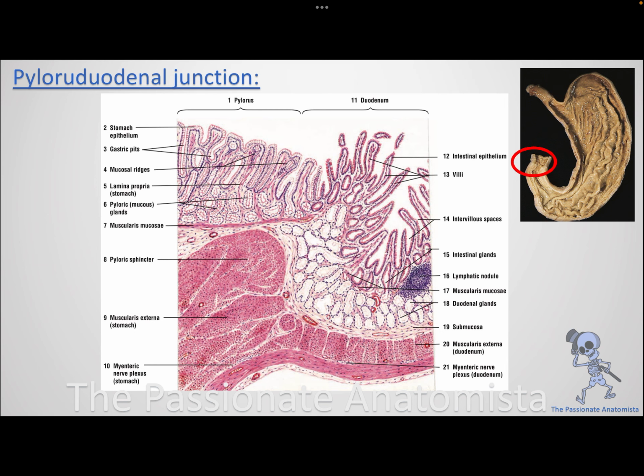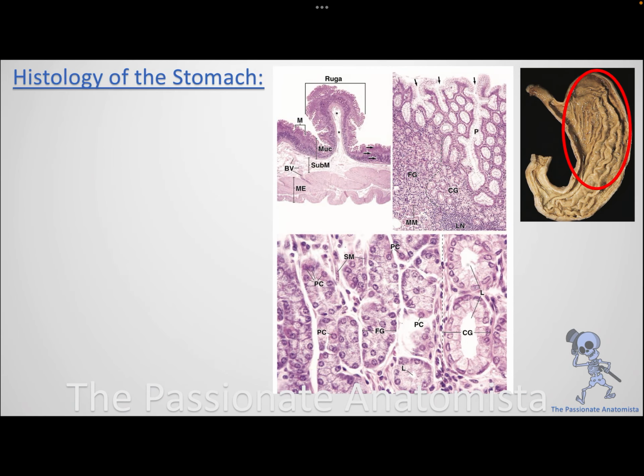And here is another one. If you look at this, the rugae of the stomach, the submucosal fold, what's in the core here is the submucosa. It's not the lamina propria. This is different than the villi, which you're going to see in the small intestine, because this is a stomach. Here I have these dark things. This is all the mucosa, but my core is submucosa.